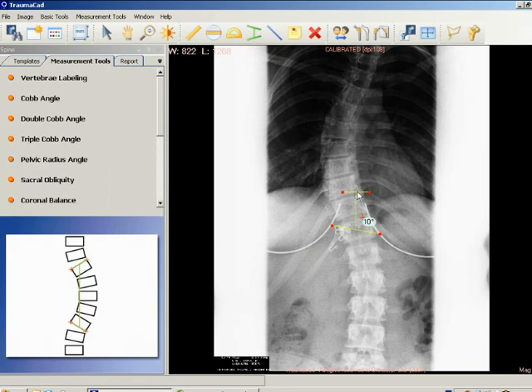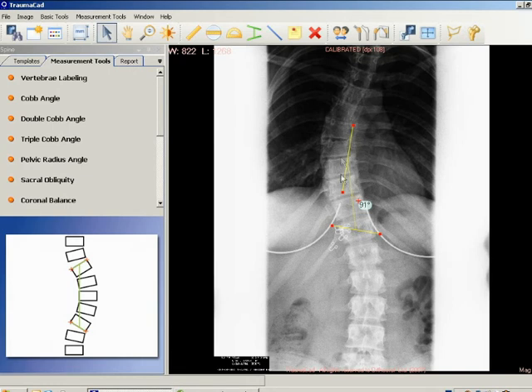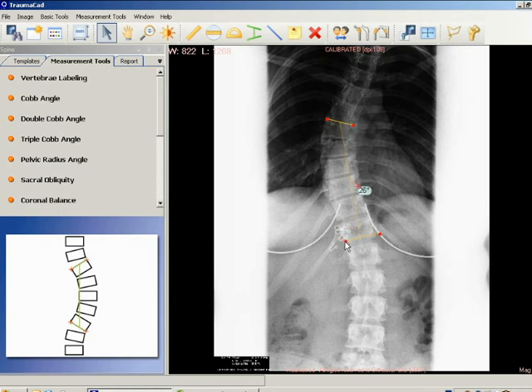A line is drawn along the superior end plate of the superior end vertebra, and a second line is drawn along the inferior end plate of the inferior end vertebra. The angle between these two lines is measured as the Cobb angle.